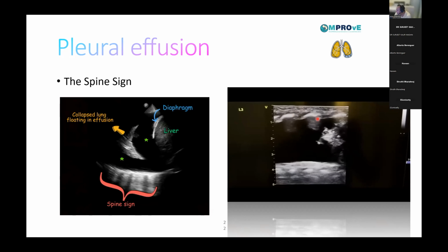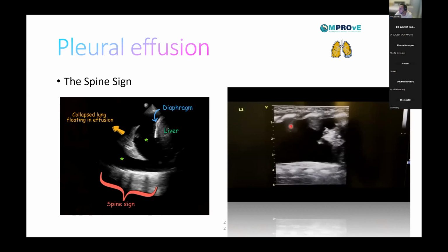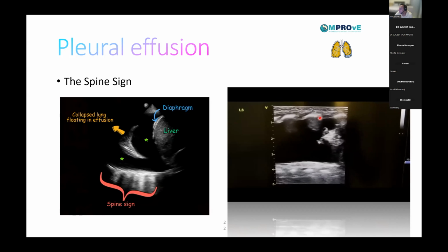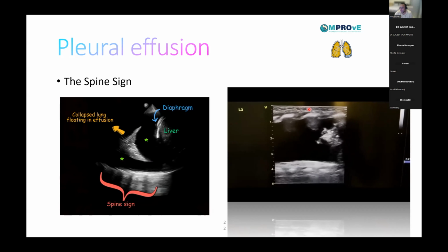And this is just an example. So this is L3. What I'm doing in this particular ultrasound at this point is trying to quantify the area of maximum pleural fluid. I'm using an extended scan, this is not convex, to quantify the rib spaces and see where my maximum pocket is. In that, what I can see is ribs. I can see some element of rib shadow there. Then I've got this quad sign with an area that's anechoic. But over here, I can see vertebrae. This is the classical spine sign. And that's a decent pocket of fluid that I can tap quite safely.